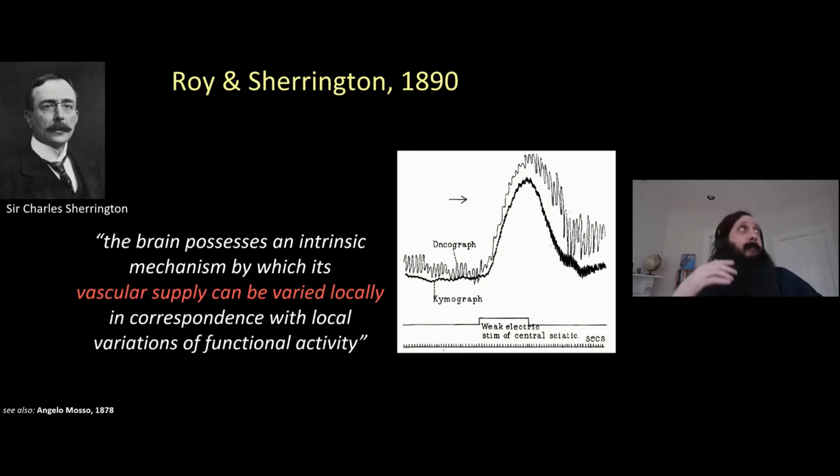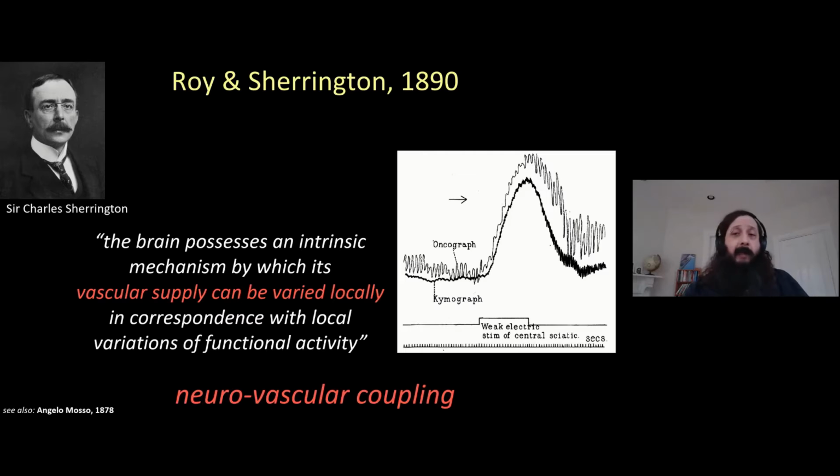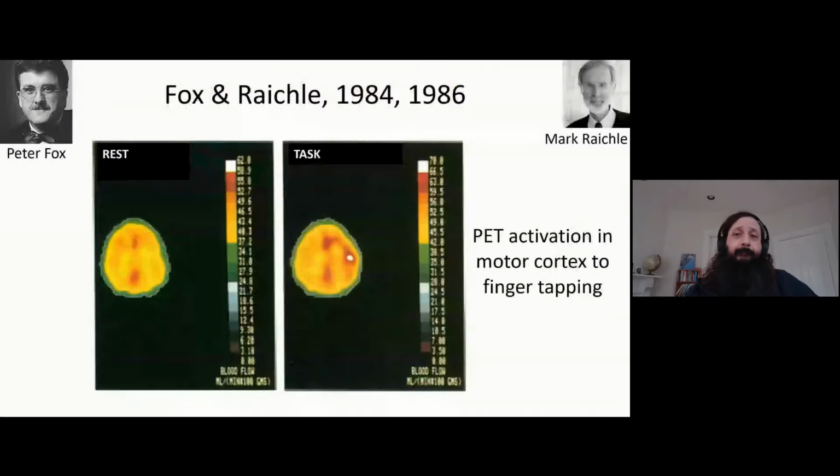And so this may not be hugely surprising. When the neurons fire, they have more energetic demands and more need for glucose and oxygen for metabolism. So it makes sense that the brain would have the capability to deliver fresh oxygenated blood to the brain regions where it's needed. And so this phenomenon is called neurovascular coupling. And a key question in human fMRI today is, how precise is the blood flow regulation in the brain, and how well do these hemodynamics reflect neuronal activity?